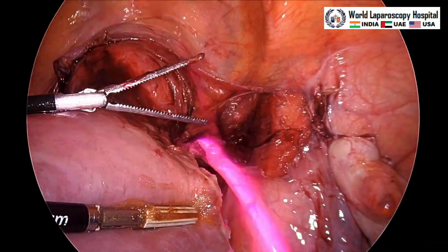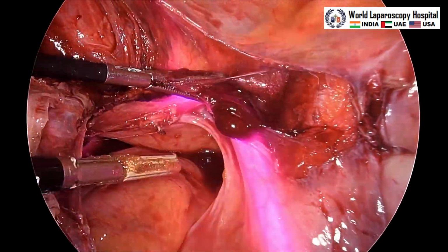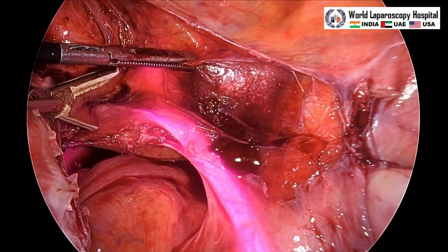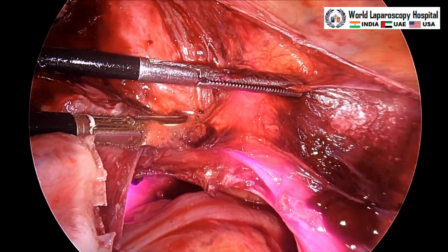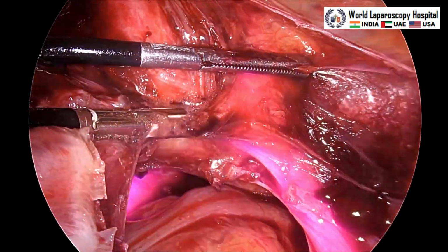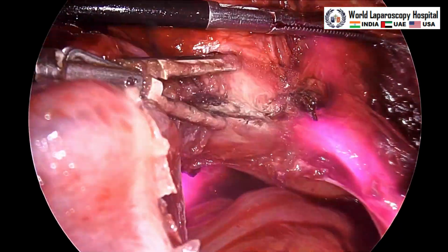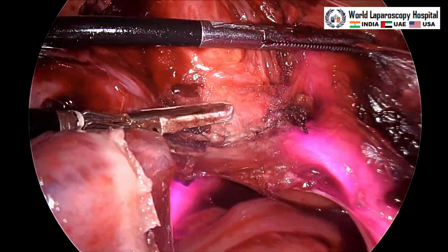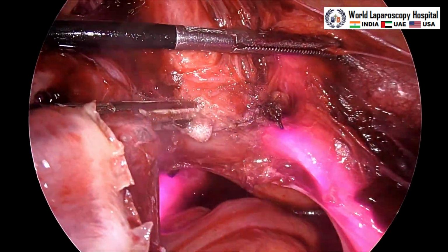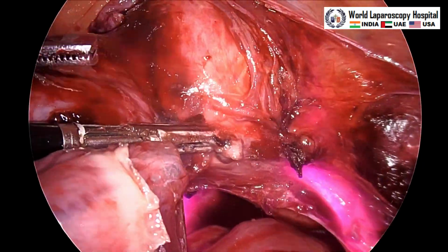Now again contralateral traction will be given, and this is the right side. So this is the right side of the uterine artery getting coagulated away from the ureter. Laterally the ureter is visible, so it is safe, and it is coagulating here and cut. Then a little bit of Mackenrodt's ligament also will be cut, and this side is also good. So this is only a 3-port surgery, that's why this side is more difficult. Ideally the beginner should do 4 ports.